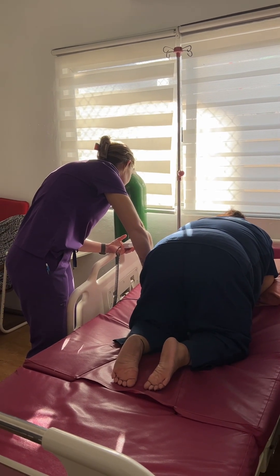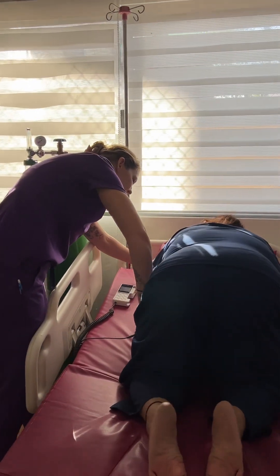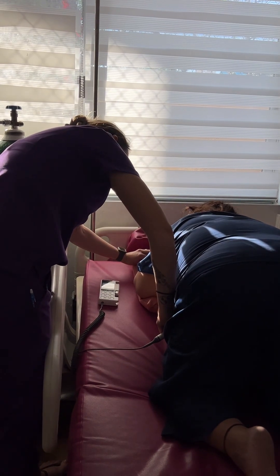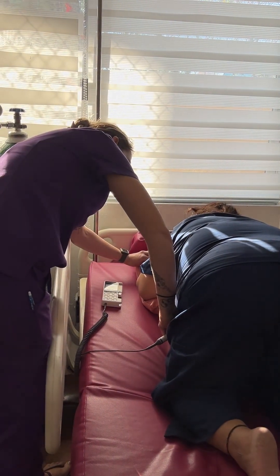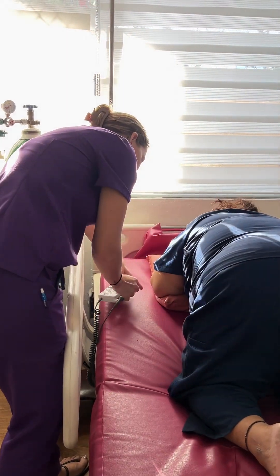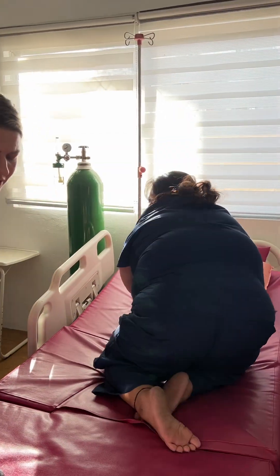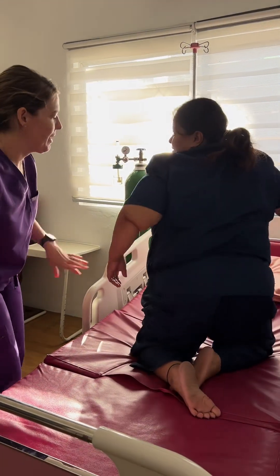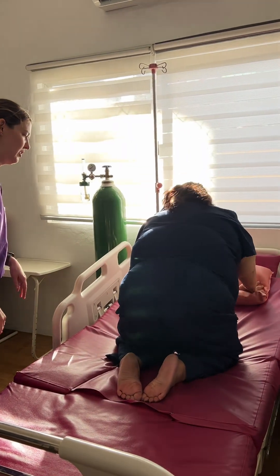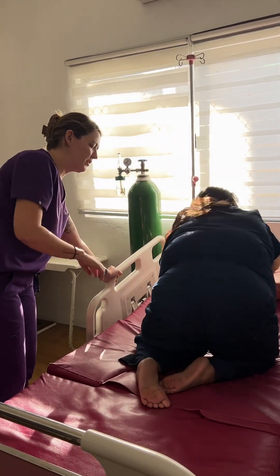Can I feel your pulse? Her pulse is about 88, but the baby's heart rate is down in the 60s now. This is still not a good position for your baby — your baby's showing signs of distress. Can we get you in a different position again? Either side, however you feel comfortable, but I think the baby felt better on the other side.